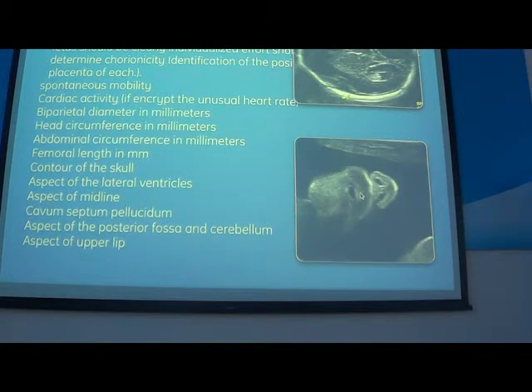What I am doing on all my screening examinations, I add this view.